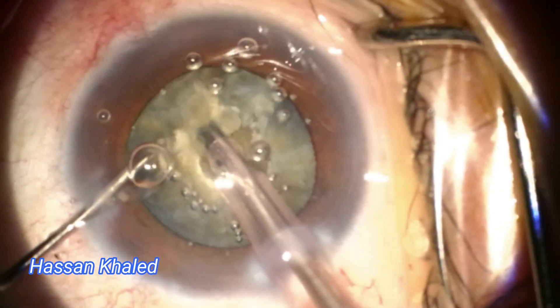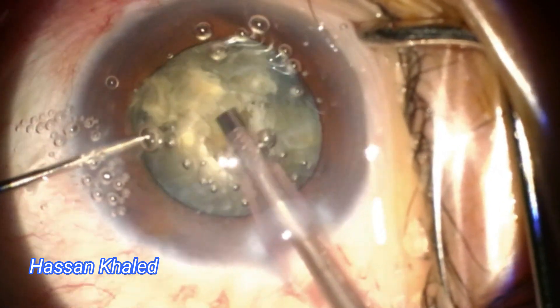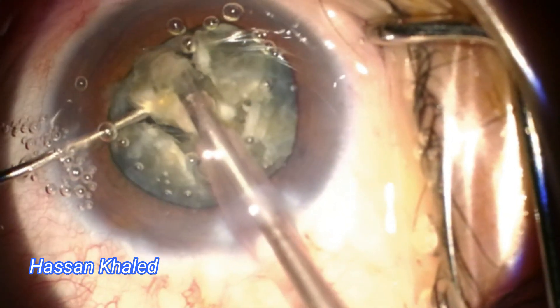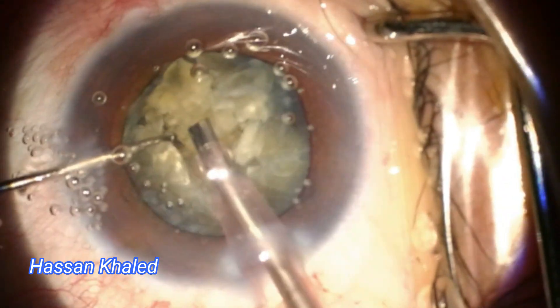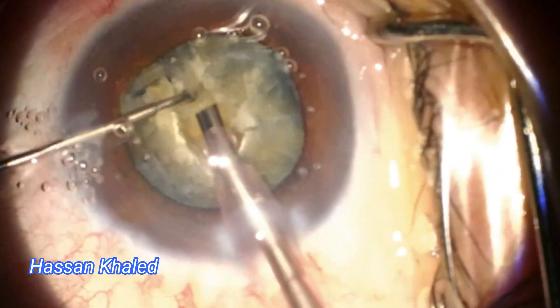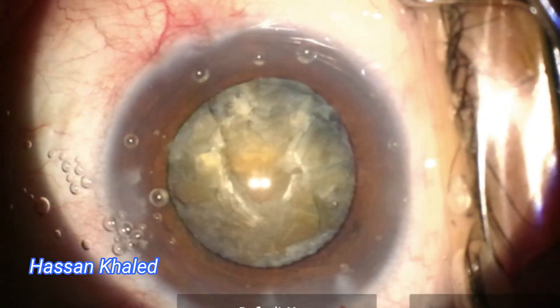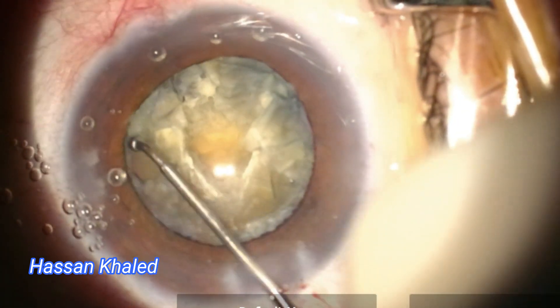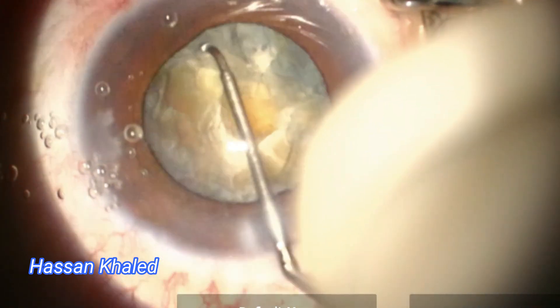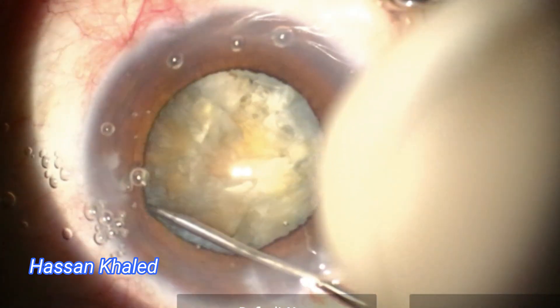As we can see, I failed two, three times in splitting this dense nucleus into halves. So I decided to inject dispersive OVD inside the anterior chamber, then try to rotate the nucleus very slowly, avoiding any more stress on the zonule. Here is the chopper trying to rotate — now I rotate the nucleus, it's good.